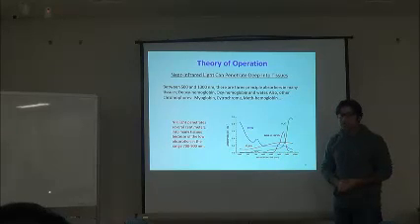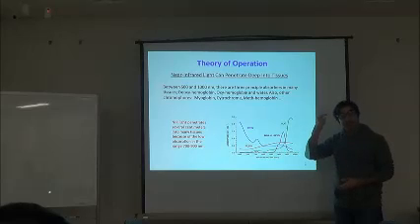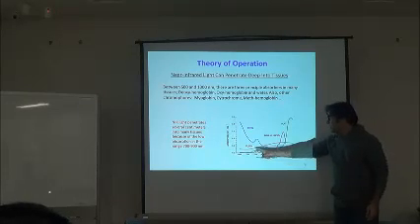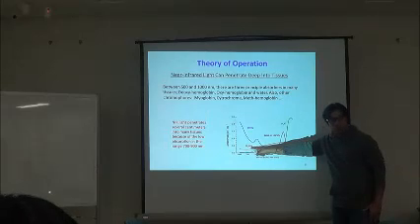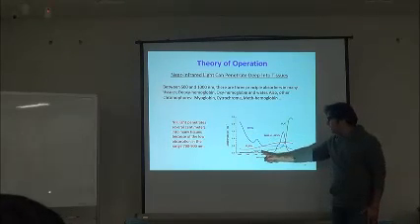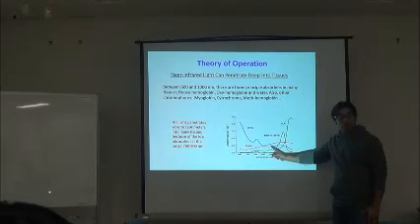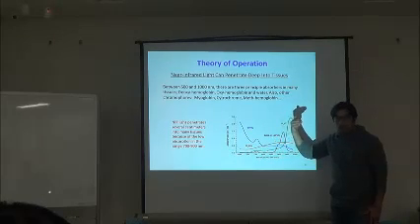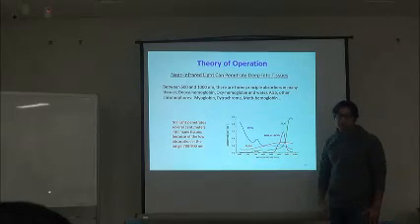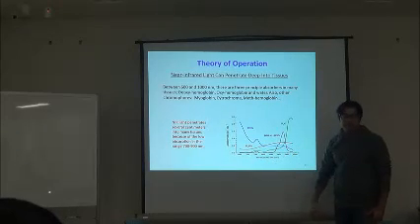It does not give us useful information about the activity of the neuronal firing. Neuronal firing can increase the oxygenated hemoglobin and decrease HHb, but it does not play any role in increasing or decreasing the water level. So once we know the water level, we can subtract it from the signal to remove the noise.